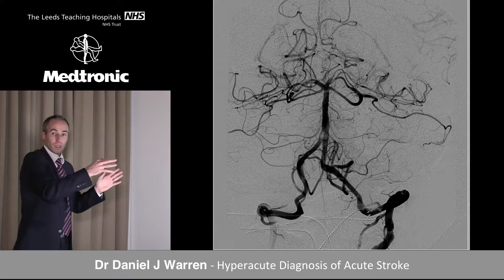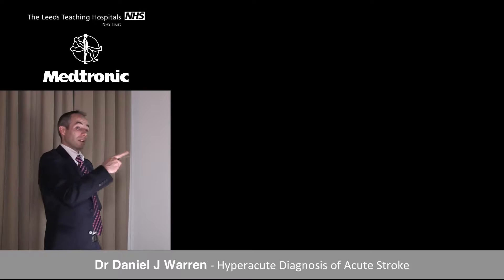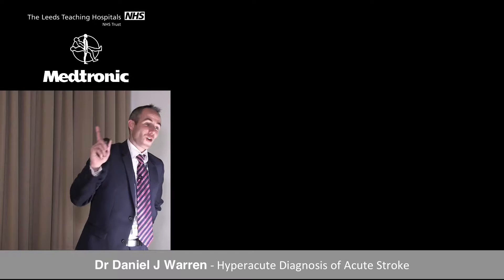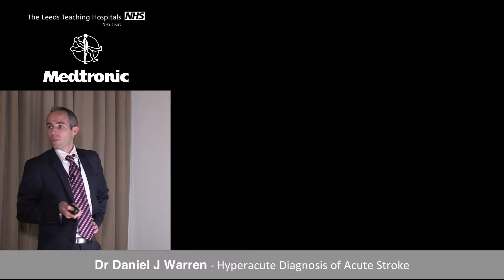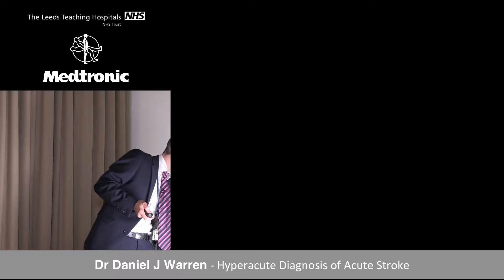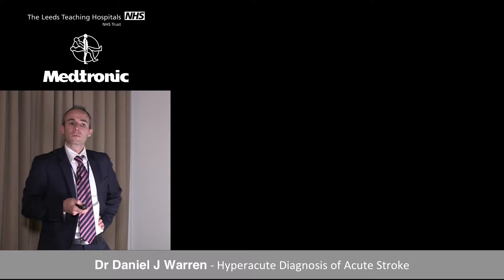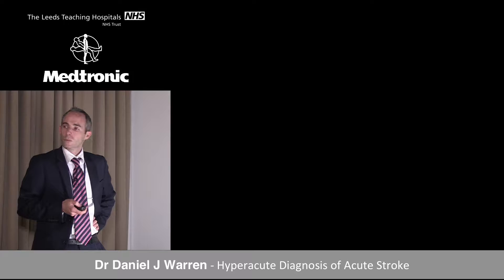Clot extraction was attempted and done successfully. Comparing initial angiography to post-thrombectomy, there is now opacification of the basilar trunk and distal vessels, though not perfect — there's a residual filling defect at the base of the basilar. In these scenarios you weigh risks and benefits: going in again risks losing all opacification. Apparent radiographic reperfusion was achieved. Discussion followed about whether to add intra-arterial thrombolysis, noting thrombolysis works in basilar territory and the longer window if clot remains.